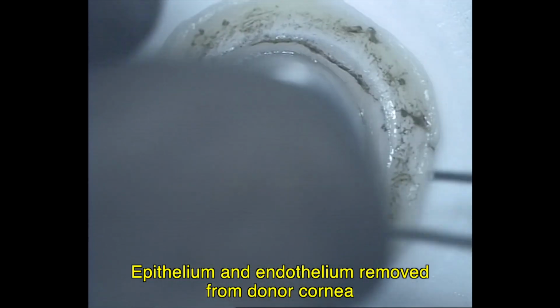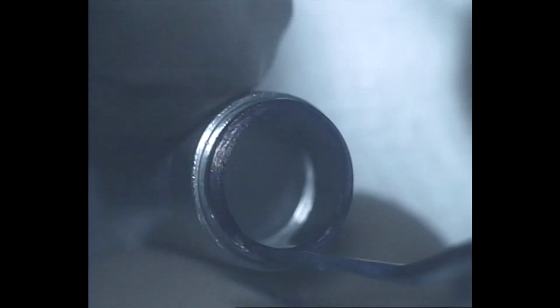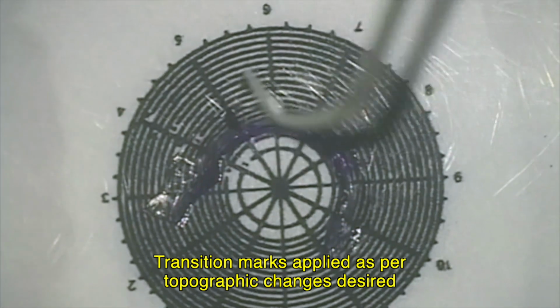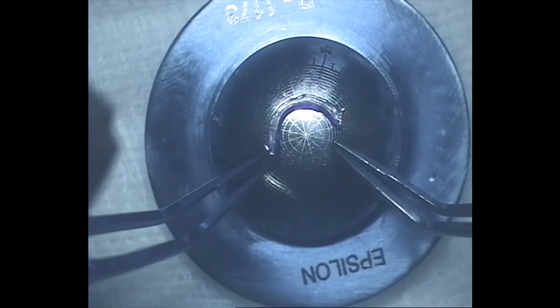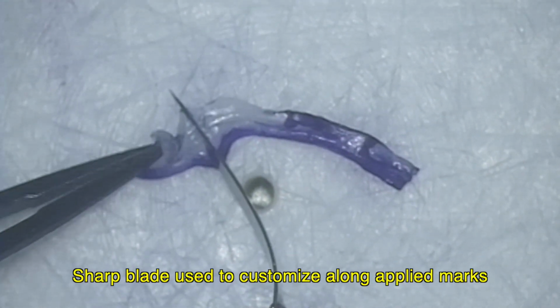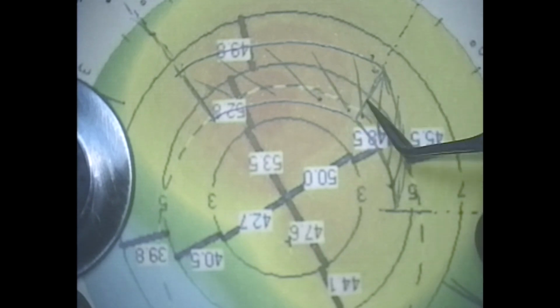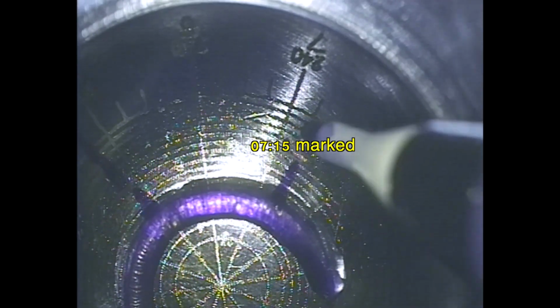We customized CAIRS by first trephining standard CAIRS using a special double-bladed trephine, placing the standard CAIRS segment on a computer-printed degree zone marker, followed by marking the required arc length and transition points with a fine-tipped inked marker. We soon got this pattern stamped on an autoclavable instrument to facilitate customization surgery further. This was then placed on a flat cutting surface, for instance a Teflon block, and cut with a sharp blade using the transition marks as reference points. We found that it gave us excellent predictability with the hand-cut segments matching well to the surgical plan. We also found it easy and quick to customize once the marks were applied to standard CAIRS.